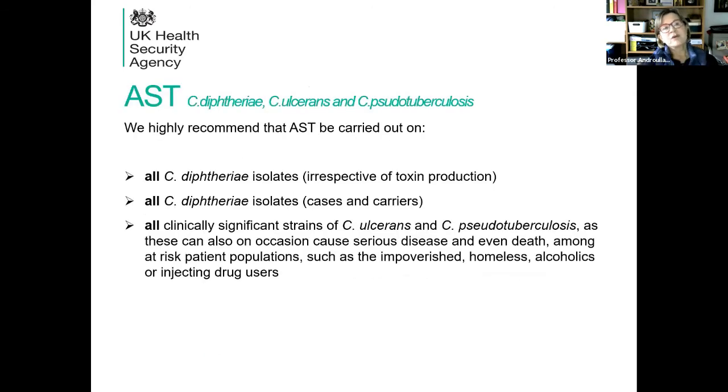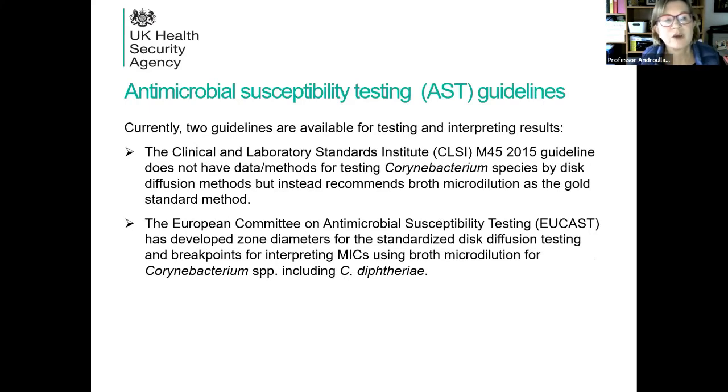Another important area is, of course, antimicrobial susceptibility testing. It's important that AST is undertaken on all C. diphtheriae isolates, irrespective of toxin production, and on all isolates from cases and carriers. There are currently 2 guidelines available for testing and interpreting results.